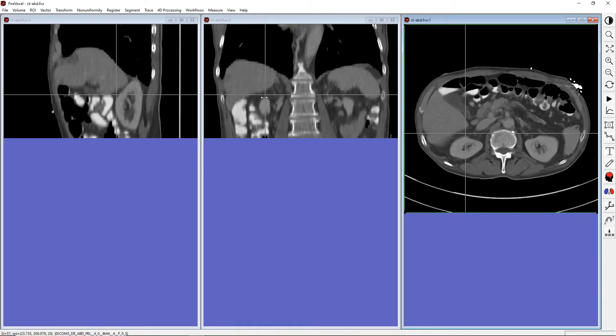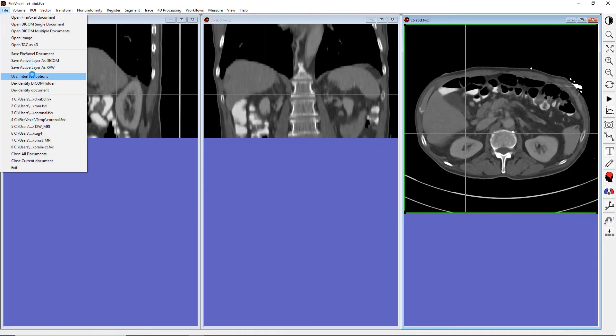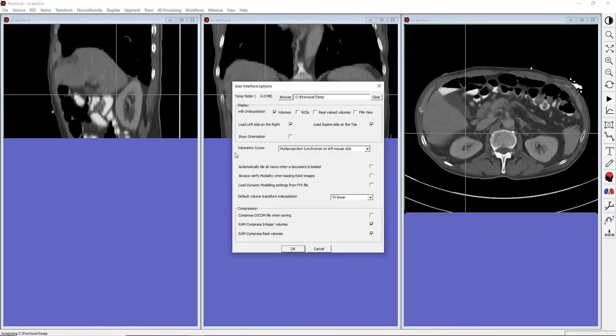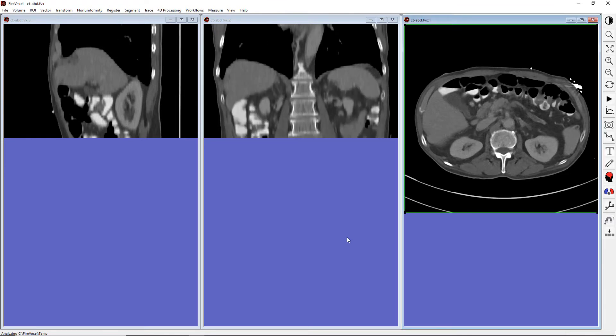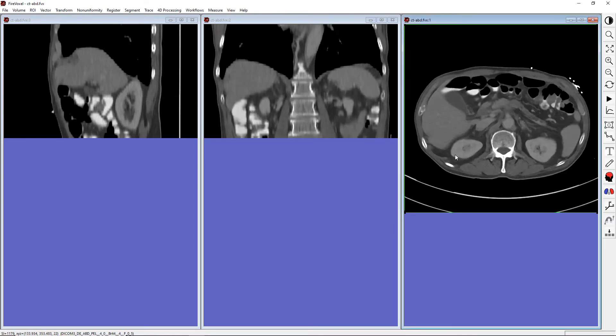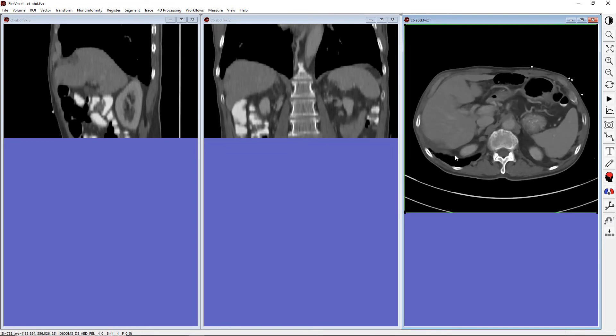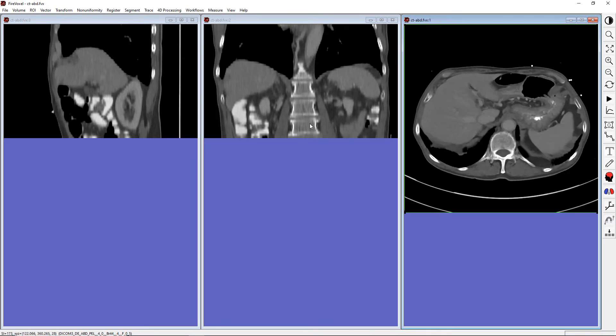To turn off this functionality, go to File, User Interface Options. Here, under Volumetric Cursor, the crosshair is activated when Multi-Projections Synchronize on left mouse click is selected. To turn it off, select Regular from the drop-down menu. Now you can scroll each view completely independently without affecting the other two views.